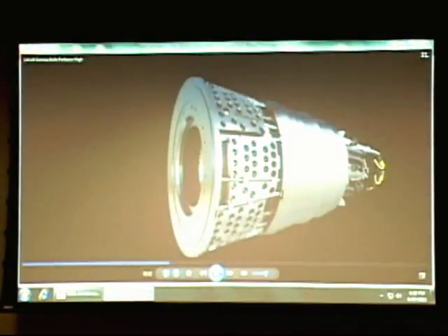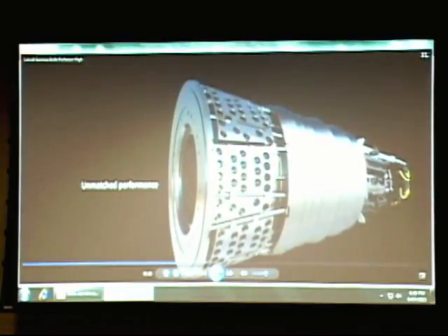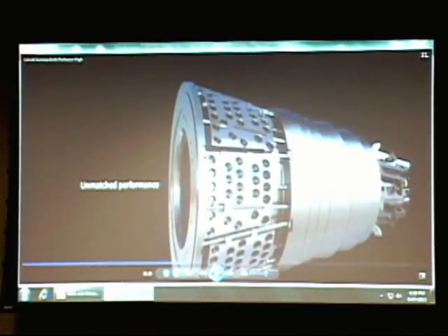So the patient's positioned in here, and on the inside you have these sectors that move the radiation sources into position. The motors that drive those sectors are the only part of the machine that's not made in Sweden. Those motors are actually made in Italy. Apparently they're extremely reliable, and the Swedish people didn't feel they could make those motors. But the engineering that goes into this is truly phenomenal. It's a wonder, this machine. This whole housing and the couch are made, like I say, in 2 different parts of Sweden, and then they come together when they're put together here.